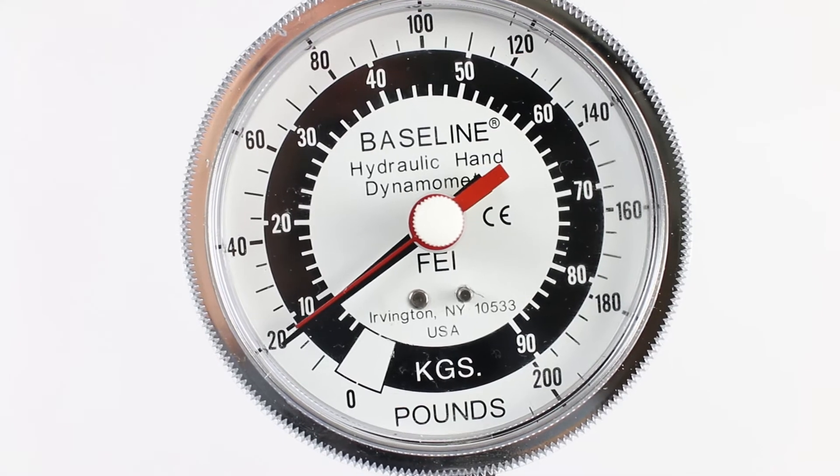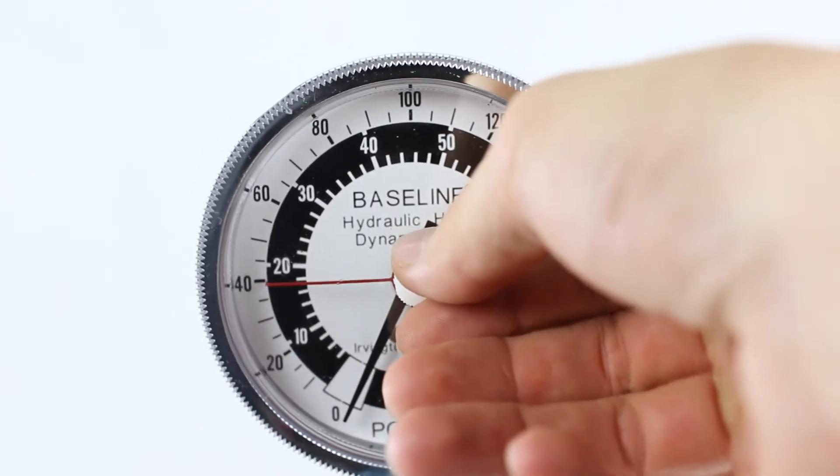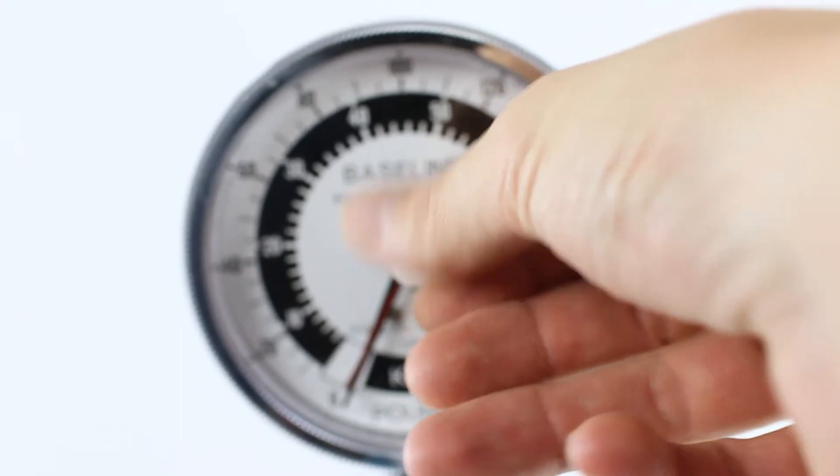Once this is done, have the patient squeeze with maximum force. Be sure to note the reading on the indicator. Then, reset the indicator to zero for the next test.